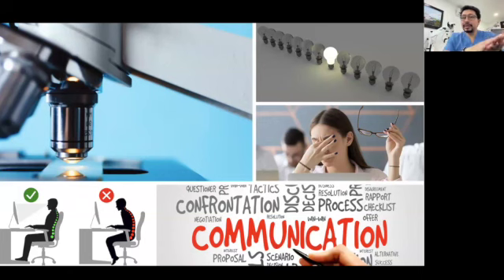The magnification is obvious, but a proper magnification cannot be properly applied if we do not have a proper illumination. And nowadays, most of the microscopes come with LED lights, so we will have a very good illumination of the operative field.